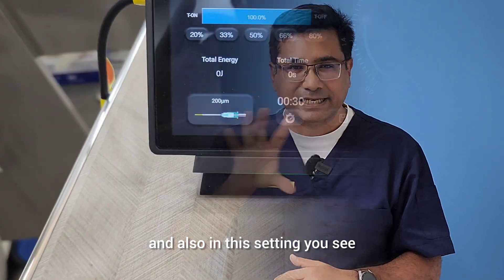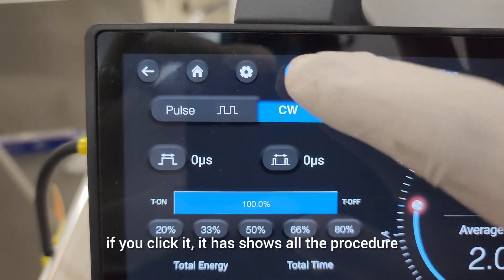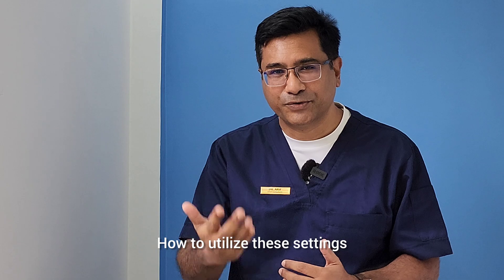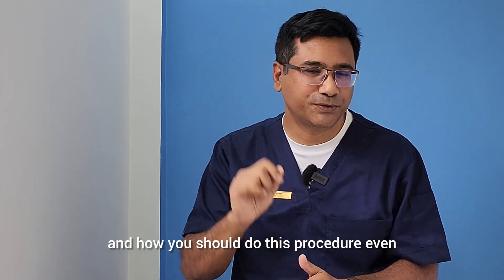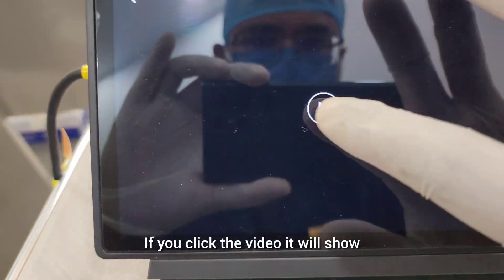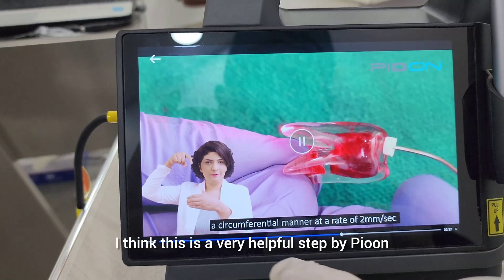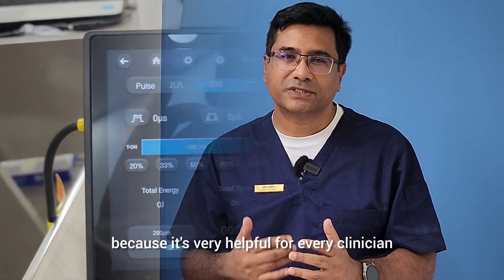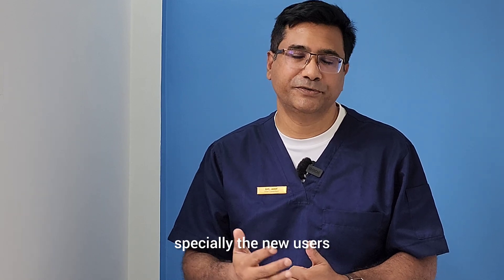In this setting there is also a question button. If you click it, it shows all the procedure description — how to utilize these settings and how you should do this procedure. It even comes with a video showing how to do the procedure. This is a very helpful step by Pioon dental laser company, especially for new users.